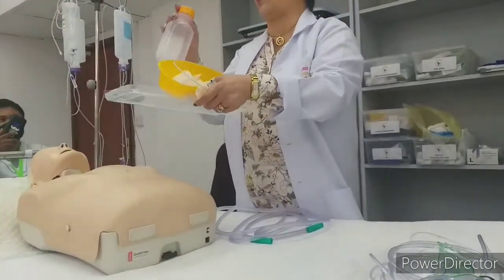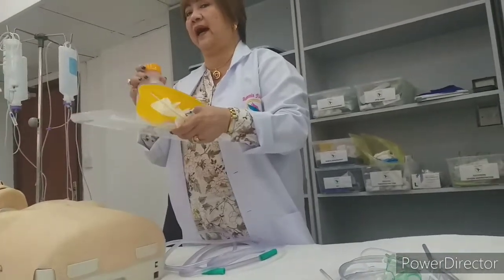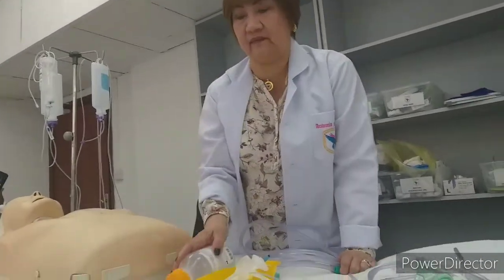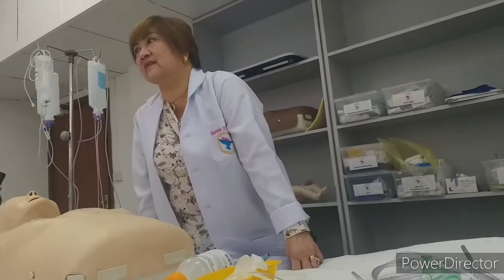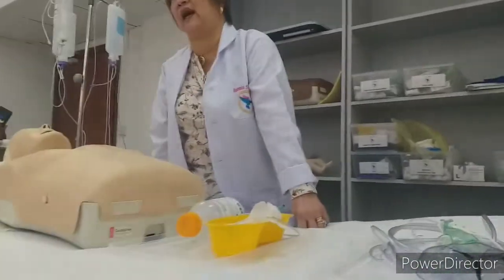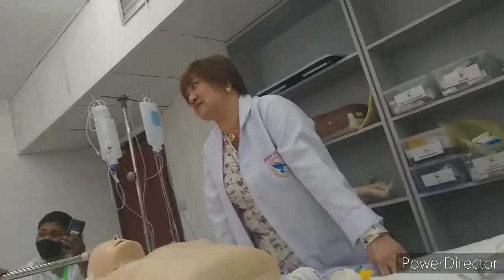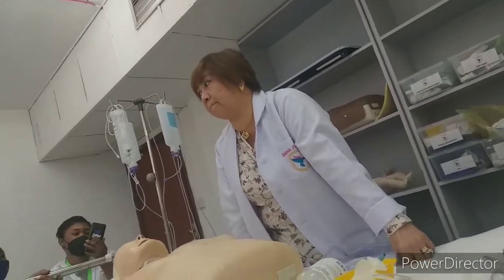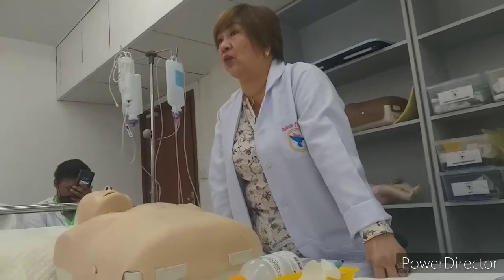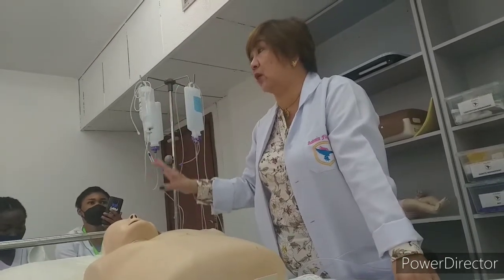As we know, our universal protocol. What does it start with? Hand hygiene. Next, gloves. Next, introduce yourself. How will you introduce? Ma'am, I'm Oni, the CNA. I'm going to take care of you. So introduce yourself at any time. Whenever you come near the patient, you have to introduce, unless you are assigned to the patient for the whole 8 hours.